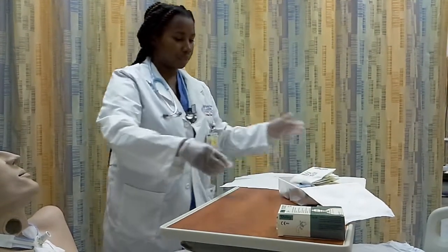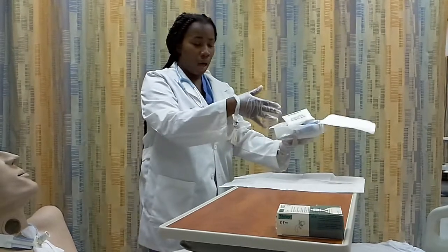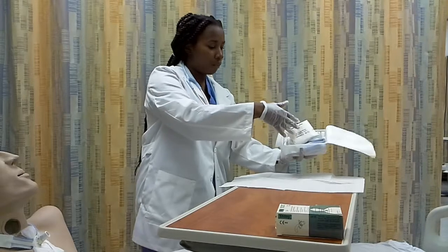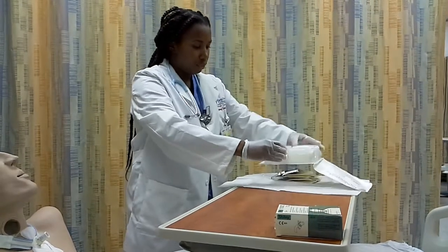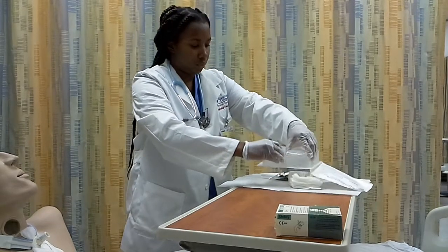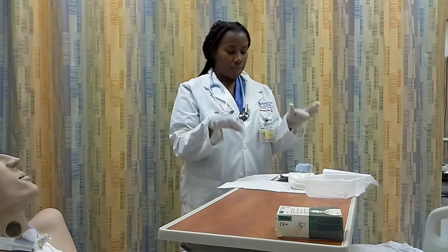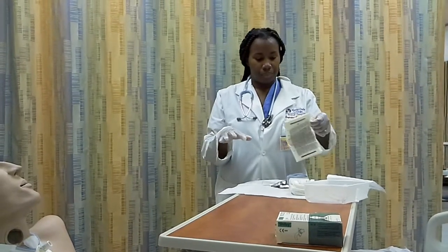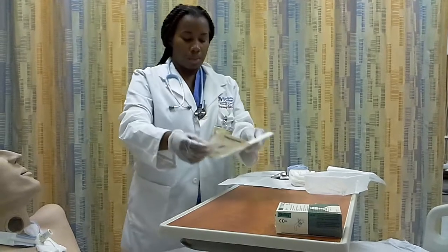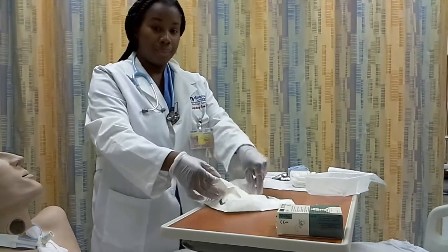Okay. So next, I'm going to go ahead and dump all of the things out that come in a tracheostomy care kit. Now everything here is sterile, so I'm going to get my sterile gloves and I'm going to don those. So I'll open them up.